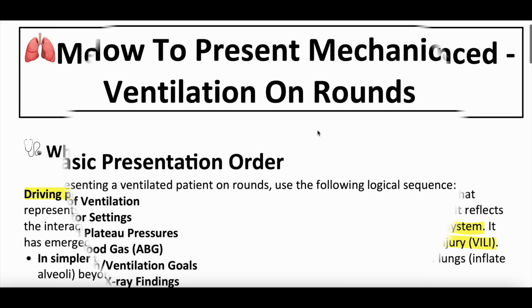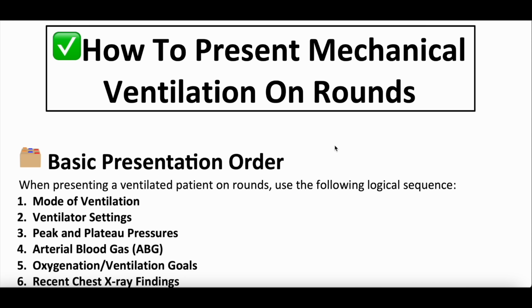Today, we are going to be talking about how to present a patient on mechanical ventilation on rounds at the hospital. This will be interesting for anyone who works in the clinical arena, whether you be a student trainee or anyone who just is presenting on rounds or thinking about how to present on rounds or wants to even figure out how to maybe teach how to present on rounds. In addition to that, it could be interesting to the general public too, for those interested in loved ones who unfortunately found themselves on mechanical ventilation and some of the things we think about. So the goal here is to show everybody how to thrive, how to impress on ICU rounds.